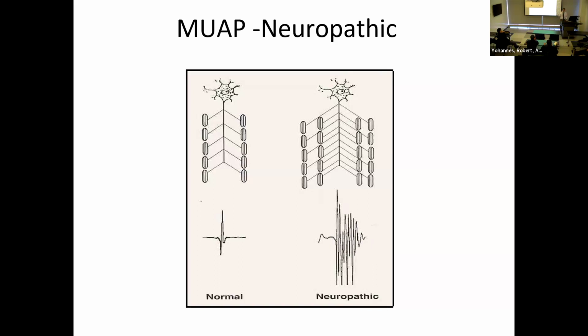The interesting thing is that if we follow the same unit over time, the more time elapses, the more myelination happens, and they're more incorporated into the unit. The unit will still be large, will still have a lot of electricity, but you'll see less of this polyphasia here.